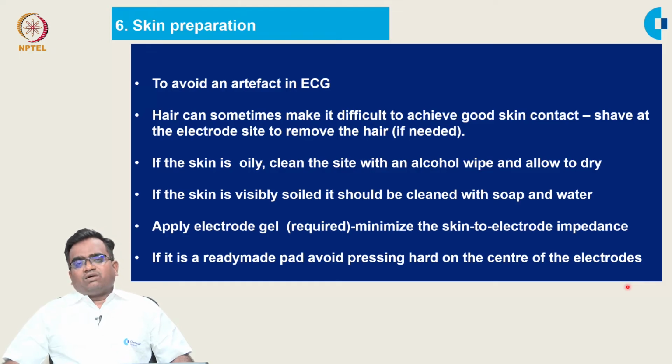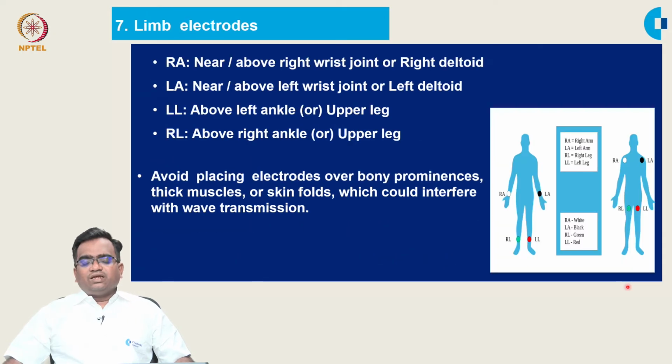Apply the required amount of gel to minimize the skin-to-electrode impedance. If the healthcare provider is using a ready-made electrode sticky pad, then the center of the sticky pad should not be pressed because it may lead to leakage of electrode jelly. Next, we are going to see limb leads.